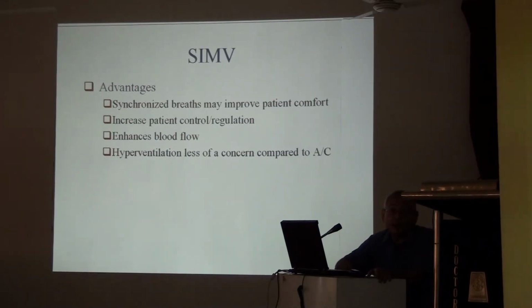Patient muscles are also working because it is assisting the respiration. Synchronized, assisting the respiration. So it is not totally controlling the respiration.